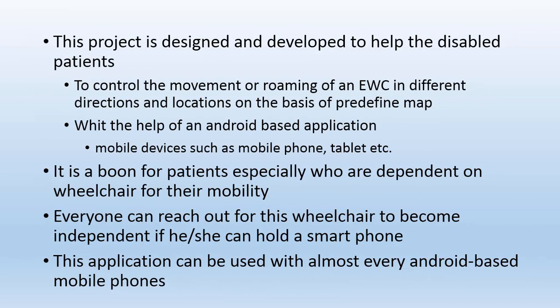This project is designed and developed to help the disabled patients to control the movement of electric wheelchair, which might be termed as roaming of electric wheelchair in different directions towards different locations on the basis of predefined map, with the help of an Android-based application, which might be a mobile device such as mobile phone, tablets, etc.